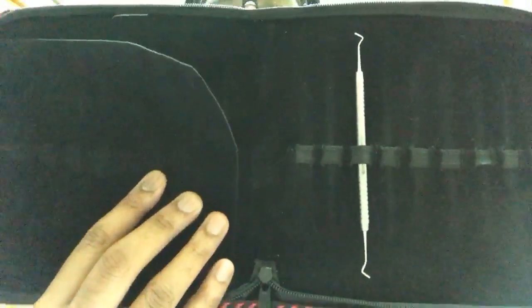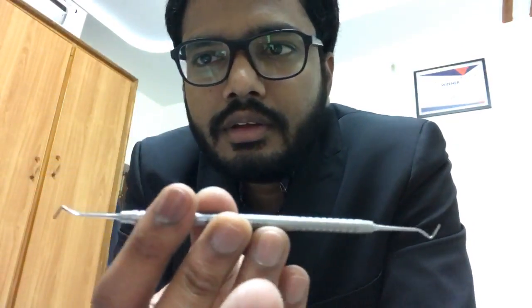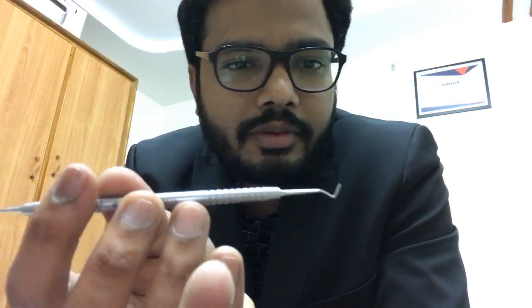Can you identify this instrument? I'm not sure whether you can really appreciate the details. So it's a double-ended instrument, that's for sure. Double-ended instrument. Yeah, we are unable to focus it because these instruments are so fine, and since it's a front cam, maybe with a DSLR, it will be possible.